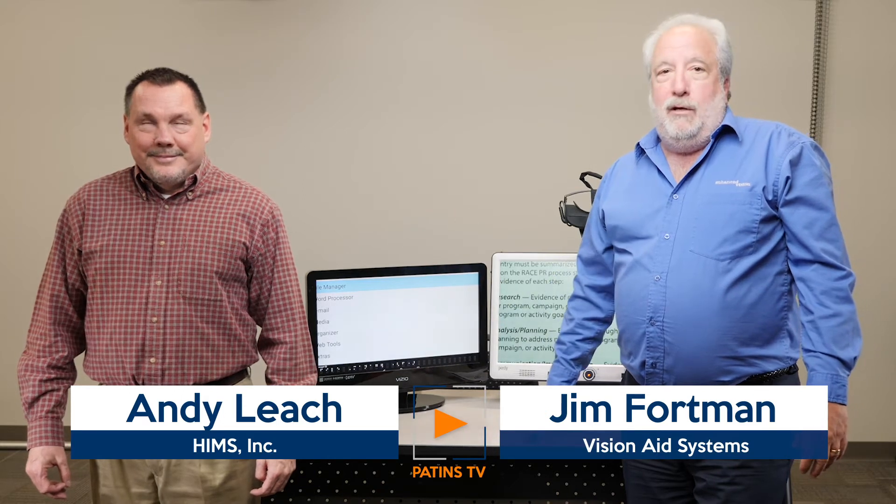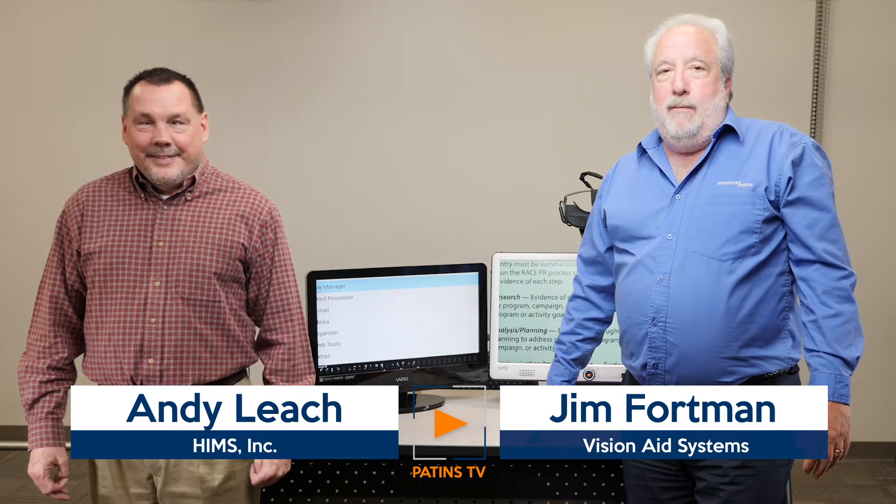I've got with me Andy Leach, he's out of Dayton, Ohio and he's the HIMS representative. Today we're going to be showing you a couple of neat new products that are kind of new to the market. The first one, starting with me, is right behind me and it's called the Jordy. Some of you may have heard of the Jordy from a long time ago — this is the newest Jordy.